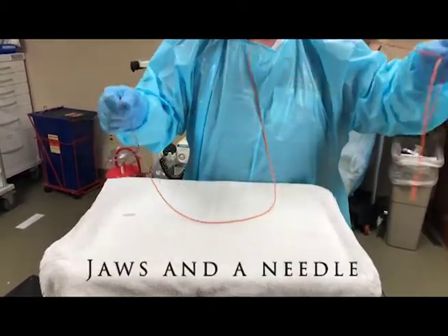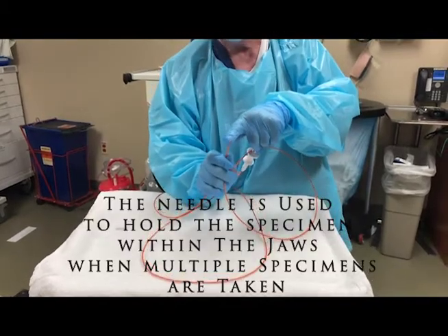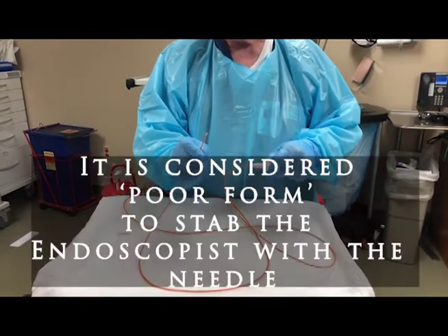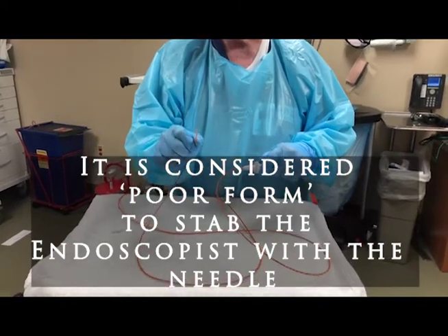And it has the jaws here — these are called alligator jaws. It also has a very sharp needle in there. The needle holds the biopsy while you're taking multiple biopsies, but you've got to be very careful not to stab the doctor when you hand it to them, so always hand it to them closed.